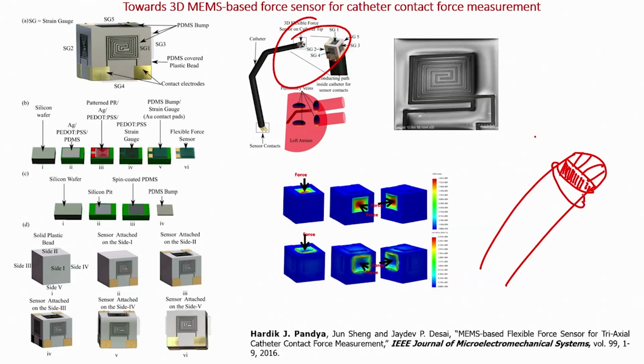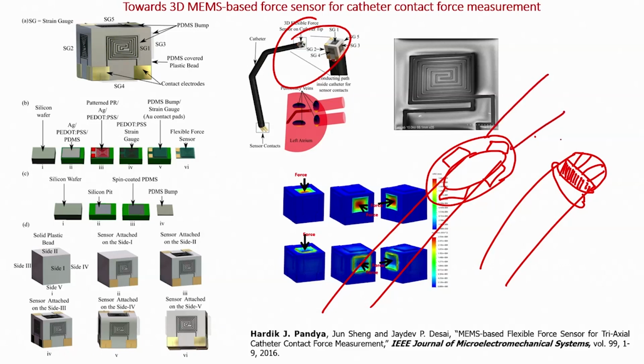But if I want to have a force sensor, what I will do is make a sleeve along this catheter and make the force sensor. So, what I am saying is I will make a sleeve like this, and along the sleeve I will have my force sensors, and here the catheter will sit. So, it will go something like here. Like this, right. My drawing may not be so cool, so do not worry about it. I hope you understand. If you don't understand, just look at me, I will show it to you, what I mean.